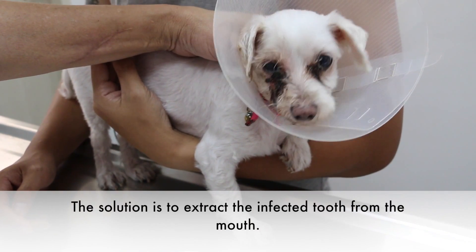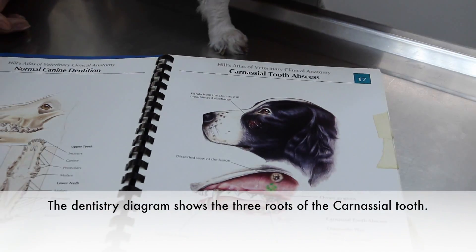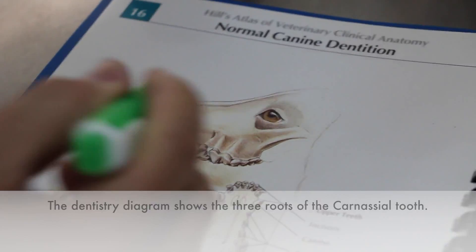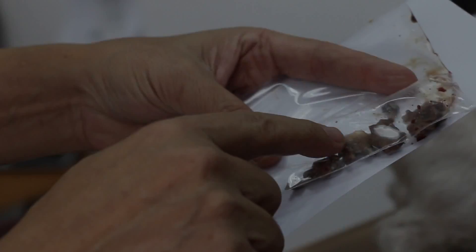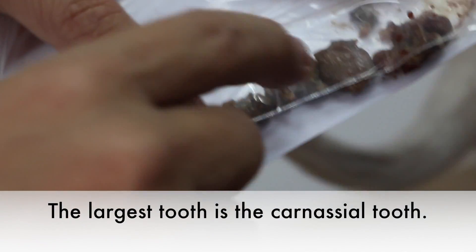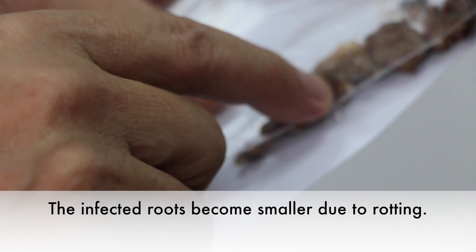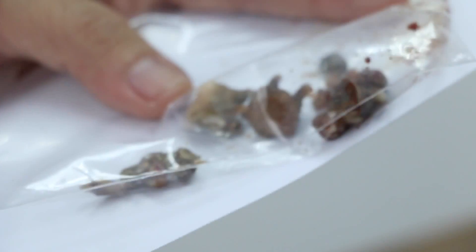But it won't be cured unless you extract this tooth out. You can see the roots here. This is the root — this is a monstrous one where the roots are infected. In fact they have become smaller already because they are rotted. Normally the roots are quite fat on normal teeth. So we have to pull this out to remove all the infection.